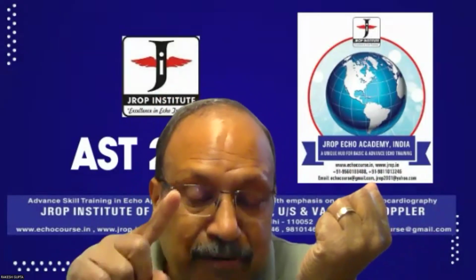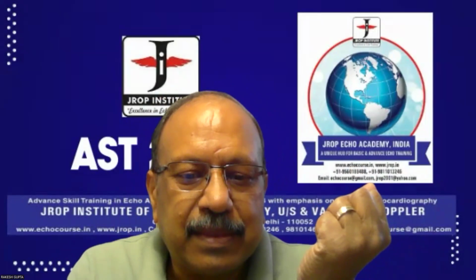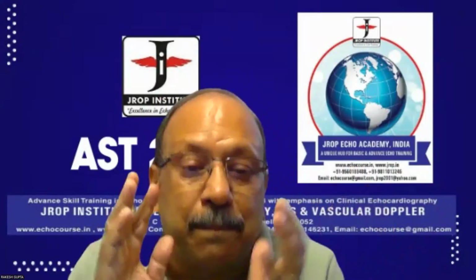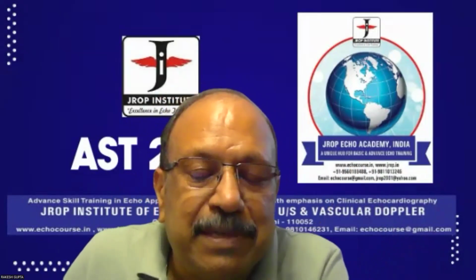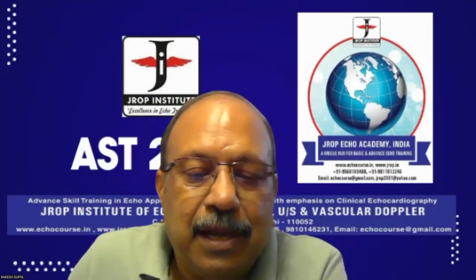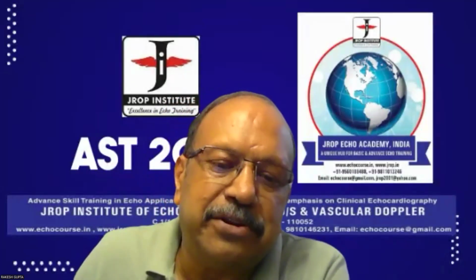If the jet is away from the mitral valve leaflet, it will be underestimated. If it's central, it will not make any difference. So if you have MS with AR, I'm not going to put my bets on pressure half time. Whatever the condition is, I'm going to put my bet on mitral area by planimetry.